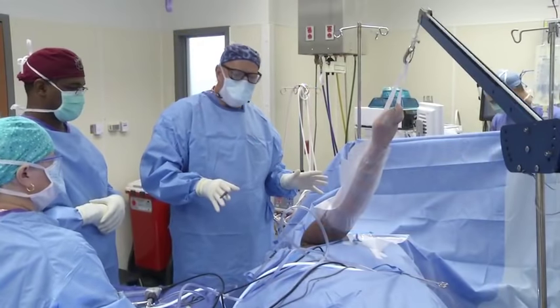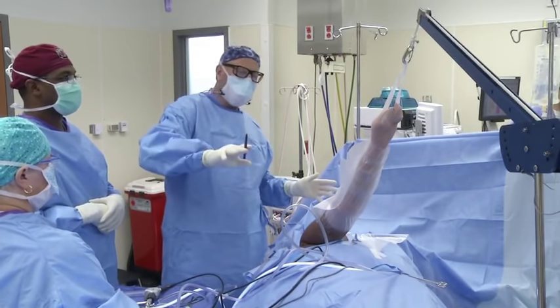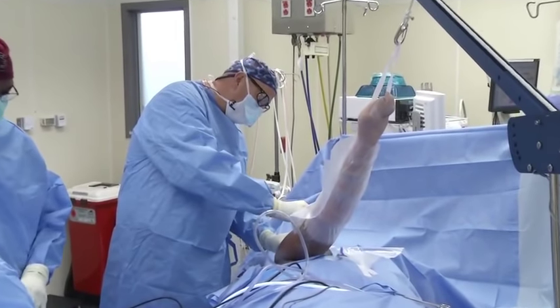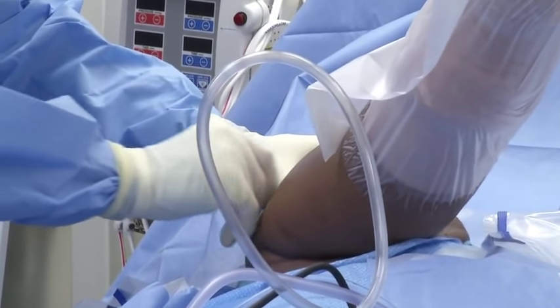So we've performed our manipulation, and now we've positioned the patient in what we call the lateral decubitus position, basically on her side, to do the arthroscopic evaluation. And we're going to identify our landmarks here. We're going to identify our portal placement.